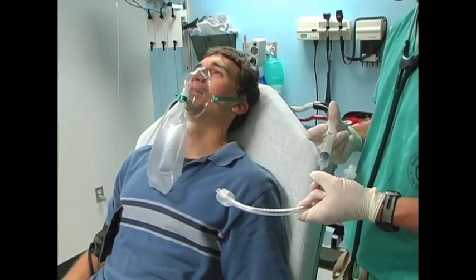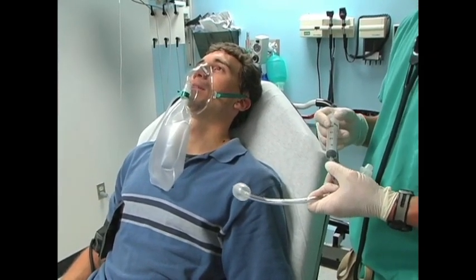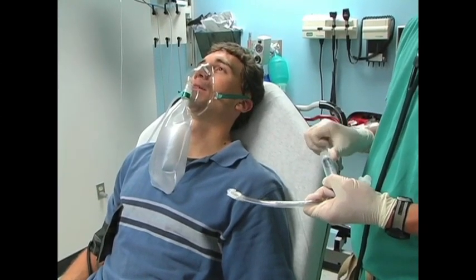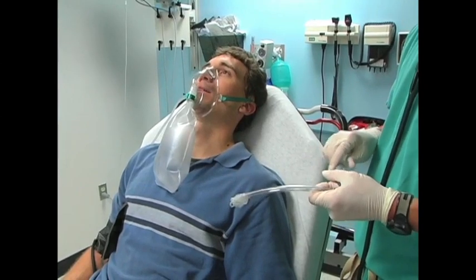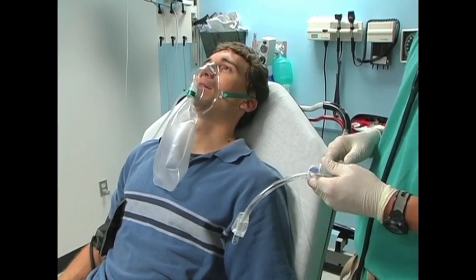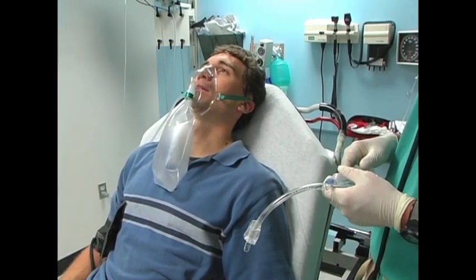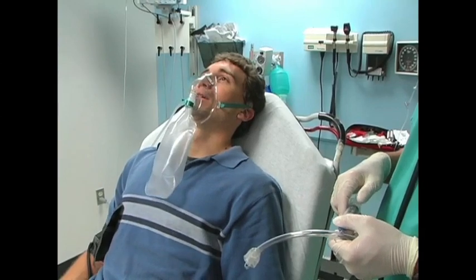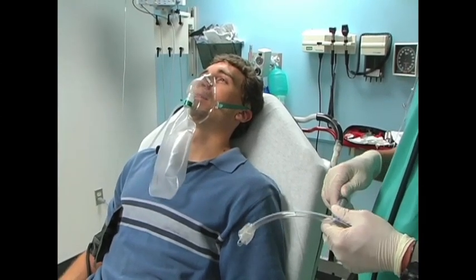Adequate ventilation and oxygenation must be ensured while the equipment is being prepared. Spontaneously breathing patients should be pre-oxygenated with a non-rebreather oxygen mask at maximal flow rates for 3 to 5 minutes. Sir, go ahead and take 4 deep breaths for me. Fully cooperative patients should be asked to take 4 maximal inspirations.